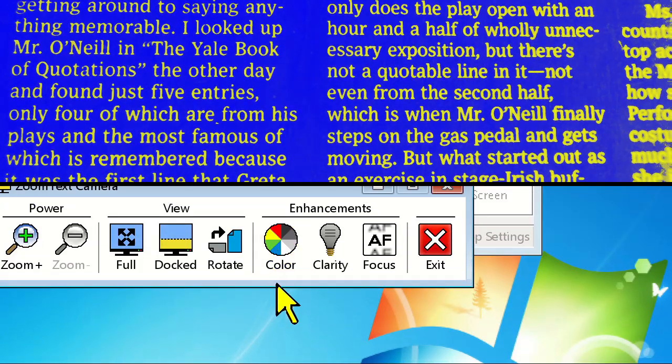The next and maybe most important feature in camera is the clarity control. This allows you to change the brightness and contrast of the camera to achieve optimal viewing. This can make a dramatic difference in rooms with poor lighting or too much light.